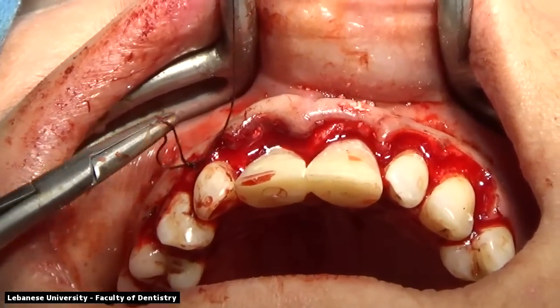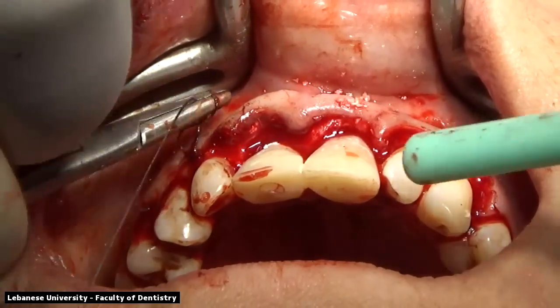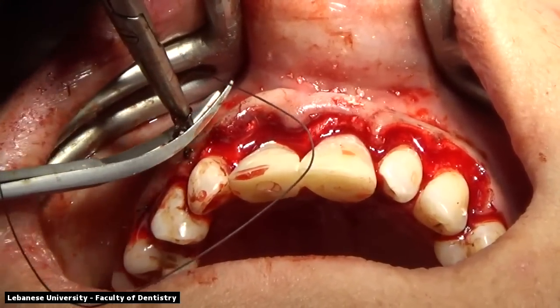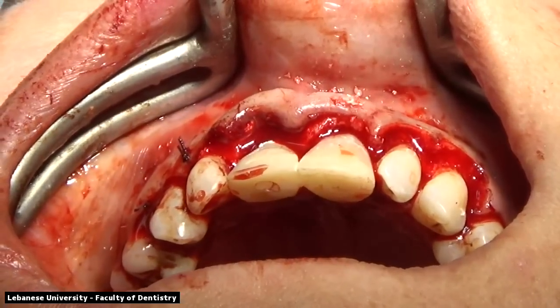Then what we need to adjust and make sure is that the buccal plate of bone is intact, and if we need to add any particulate bone graft, the particulate bone graft will help in prevention of the collapse of the soft tissue in the bone.